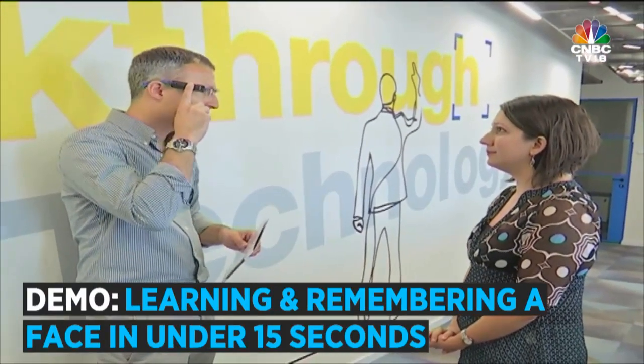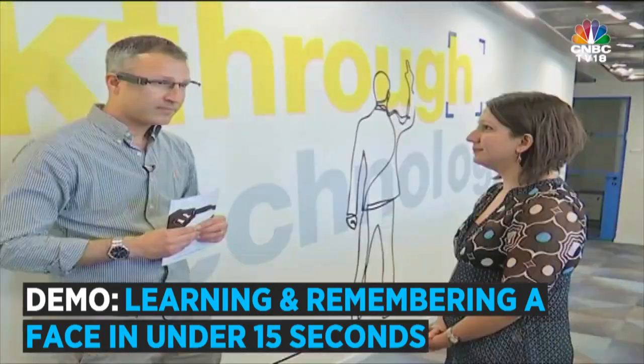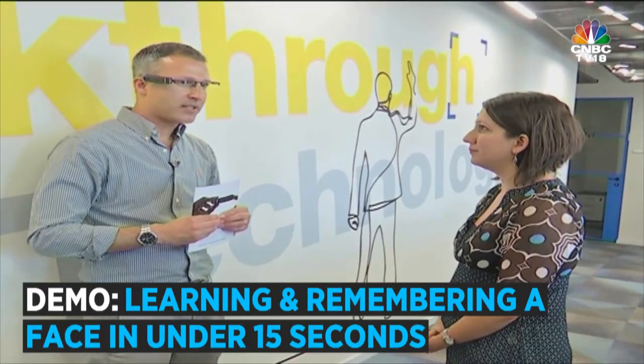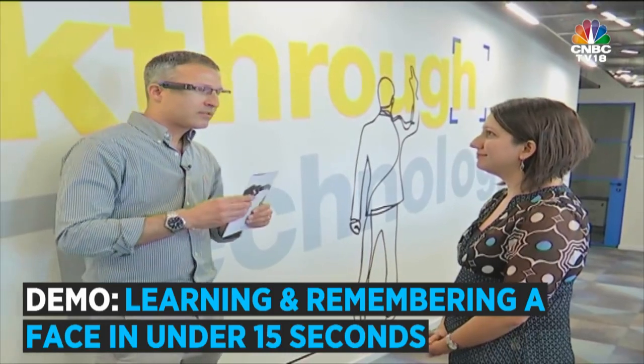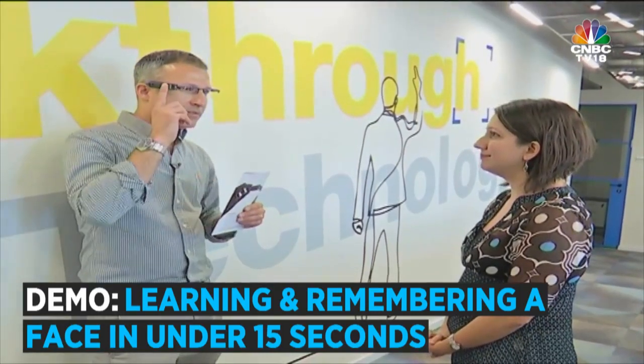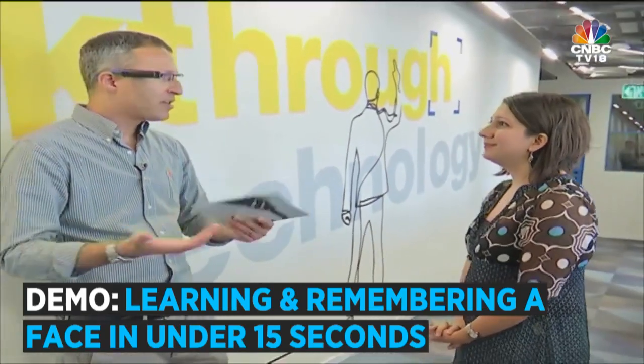Face learning. Please keep holding the bar for up to 30 seconds. Please name the person in front of you after the beep. Saina. Saina. Touch to confirm adding person. Swipe. Person learned.